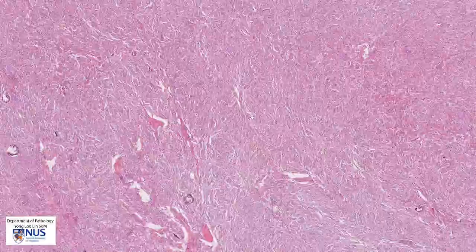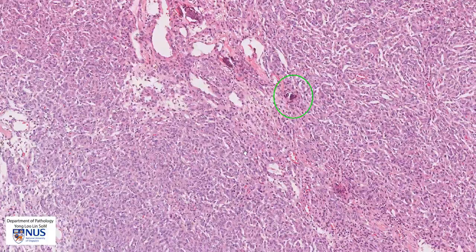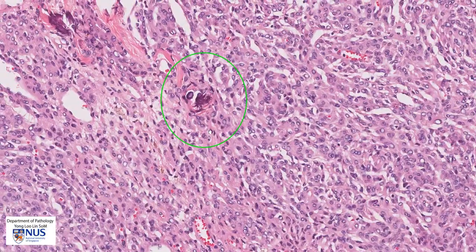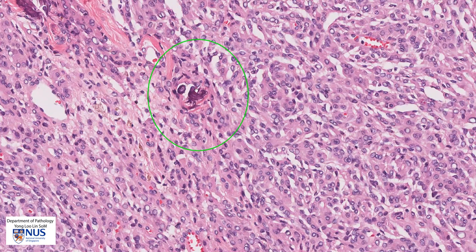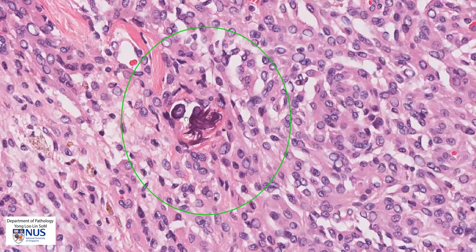Moving around, there is another feature here, and this is a calcification. If you look closely, you can see that there are some concentric rings. So this is a psammoma body, and psammoma bodies can also sometimes be seen in meningiomas.